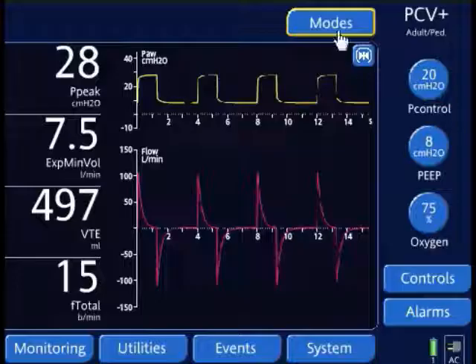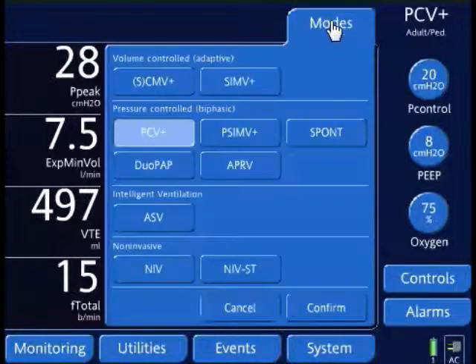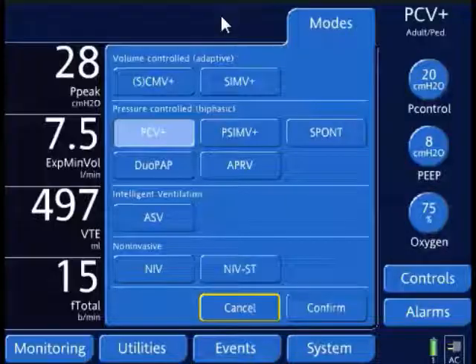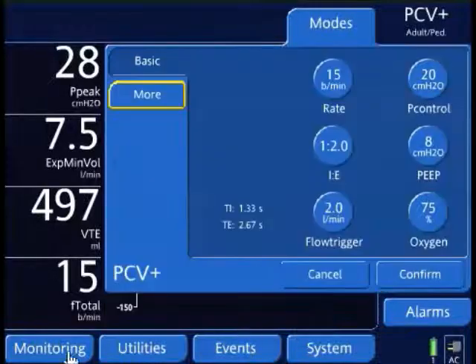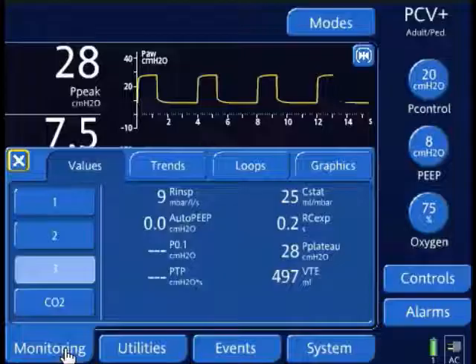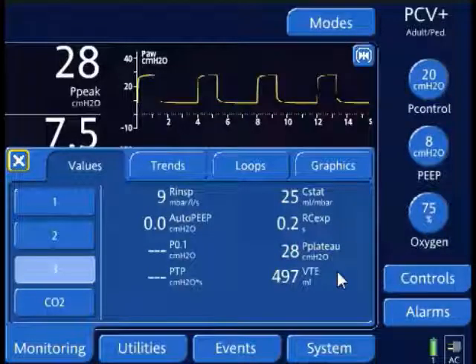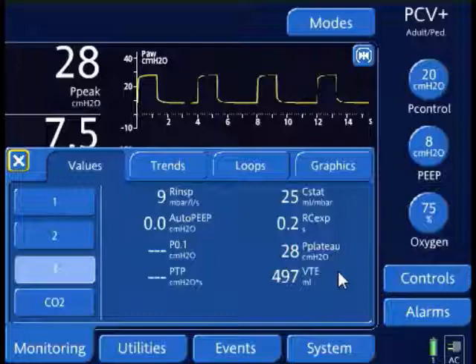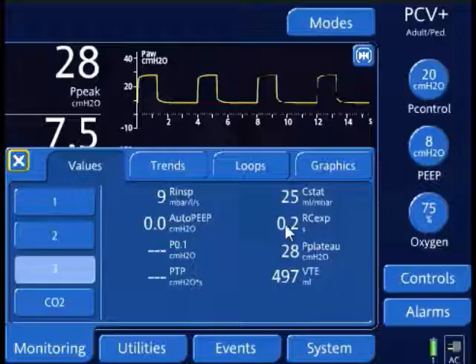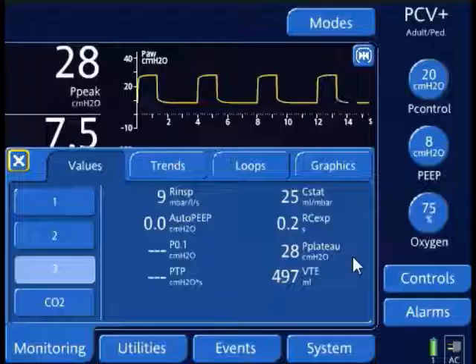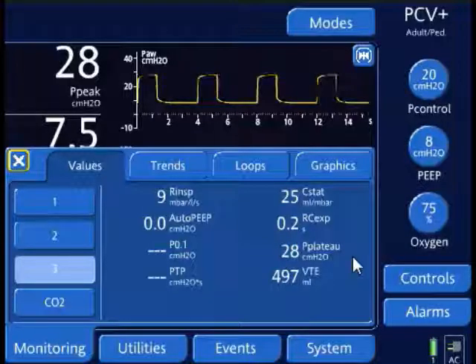Before I select airway pressure release ventilation, I want to look at a couple of things. I want to look under monitoring and take some measurements — specifically a plateau pressure. If my ventilator doesn't allow me to do an inspiratory hold maneuver for an accurate plateau pressure, I can look at the plateau pressure measurement here, which as you can see with my cursor is 28. I want to use this as a starting pressure for my P-High.